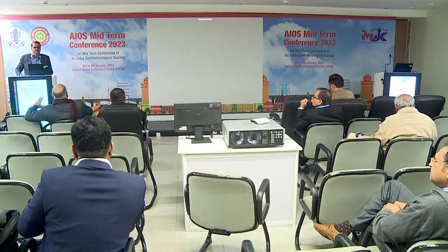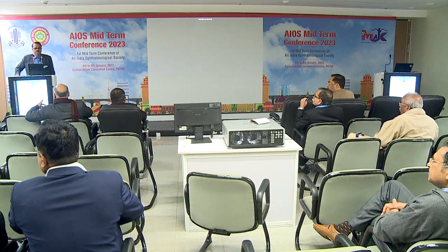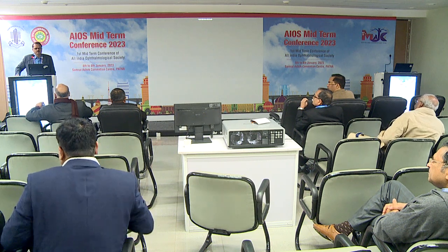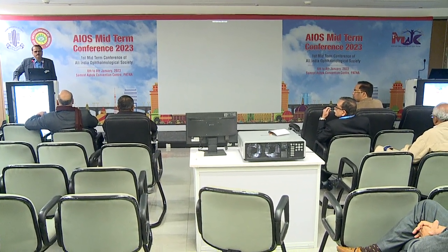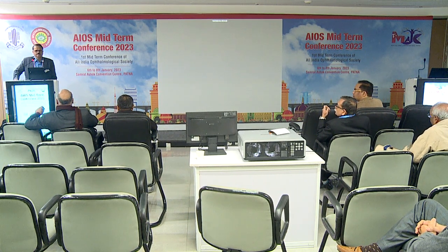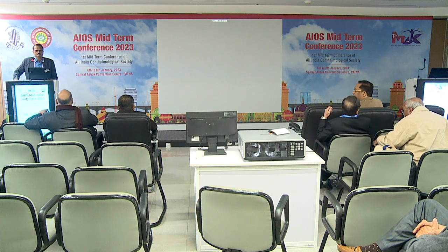So there are a few comments. Subhash has been so comprehensive, there's nothing much to add. One thing I would like to add is pre-op evaluation. A 20 megahertz ultrasound probe functions better than a 10 megahertz probe. Earlier on, we used to borrow this from the gynecologists. They use a 20 megahertz probe. Number one. Second thing was the surgeon also.